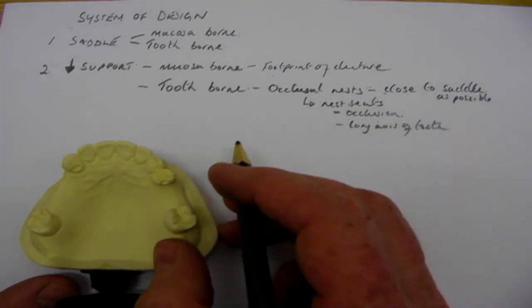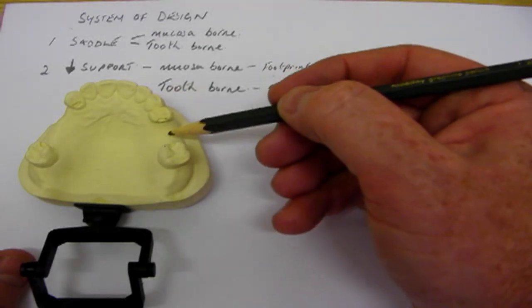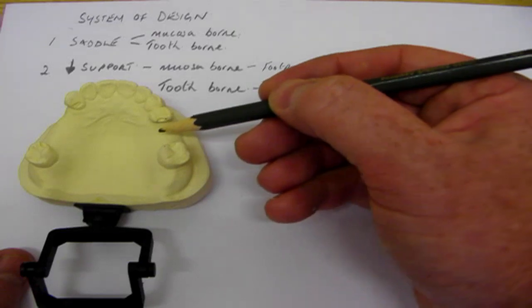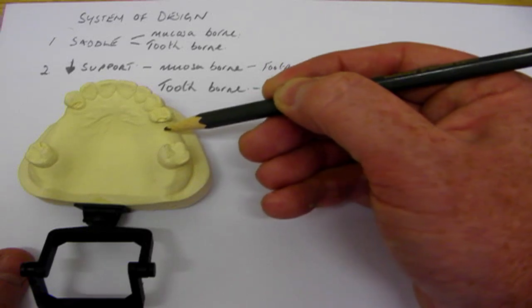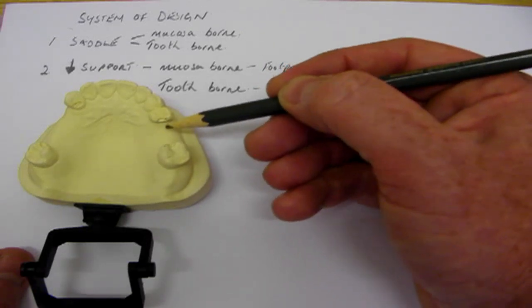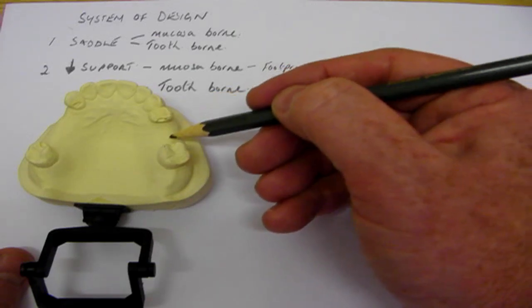Now that's relatively logical, because if we're putting load on the artificial teeth here in the saddle area, we have a metal framework that runs underneath the acrylic and to the occlusal rest, and we want that to be as rigid as possible so we keep everything nice and compact and we're not going to get as much flexing in the denture.